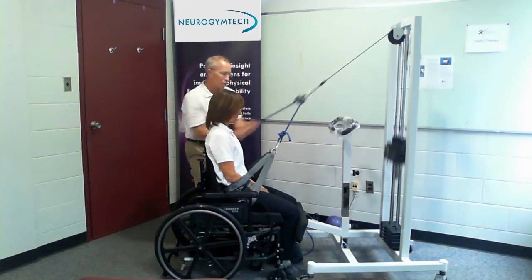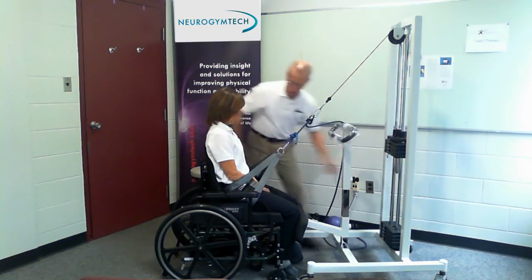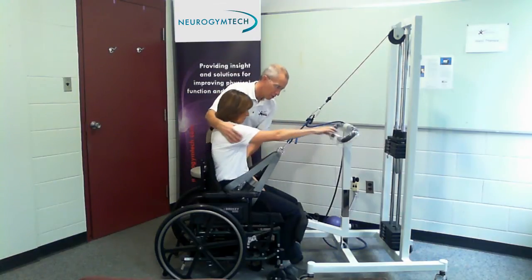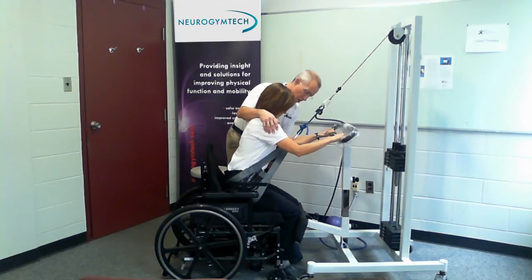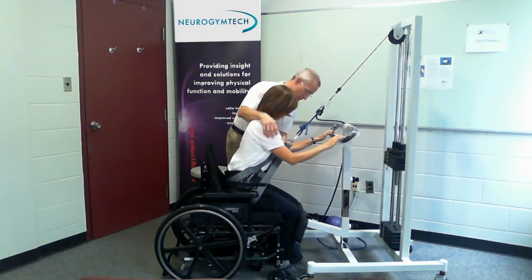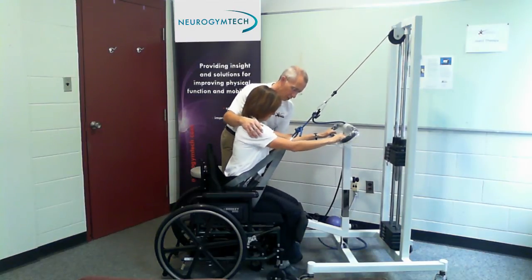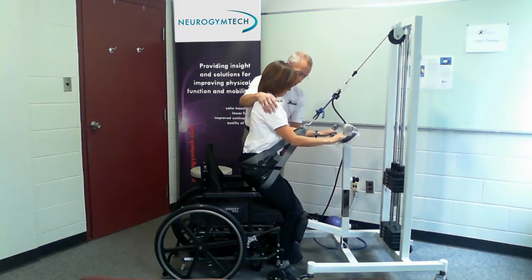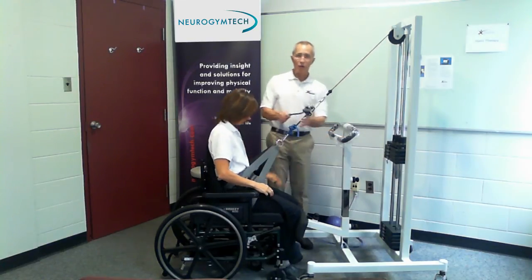I'm going to engage the weights — you'll see the patient sitting back. Put your hands up here if you can. Try not to pull so much, but come halfway up and slowly, and then back down. Try again. That's it — perfect. You can put your hands down. So that's what it looks like.